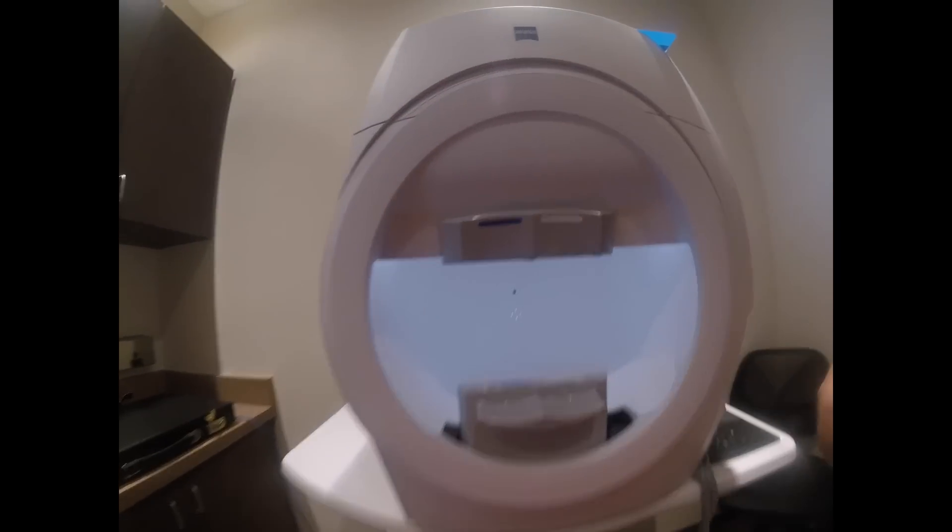So we're going to go ahead and place your chin right on the left side there. Hold on just a second, let me adjust. Alright, it looks like we're looking good there. So what you're going to do here is look at the little four dots at the bottom there. I'm going to give you this little button here that you're going to be pressing.